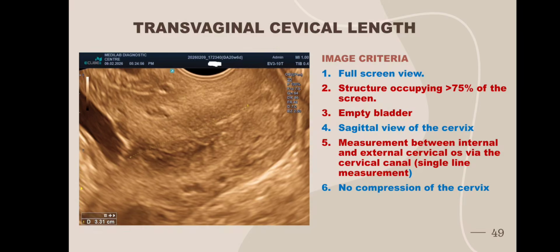Now cervical length measurement. TVS is the gold standard to measure cervical length. In this view, the bladder should be evacuated properly. Bladder should be empty.